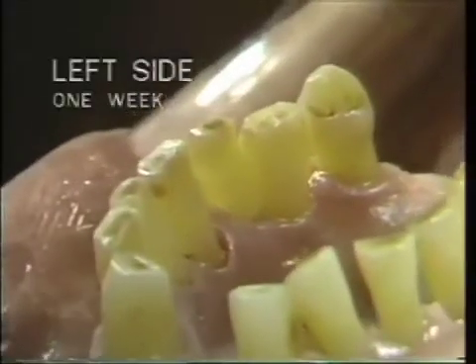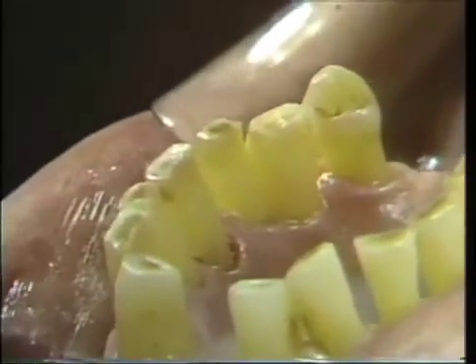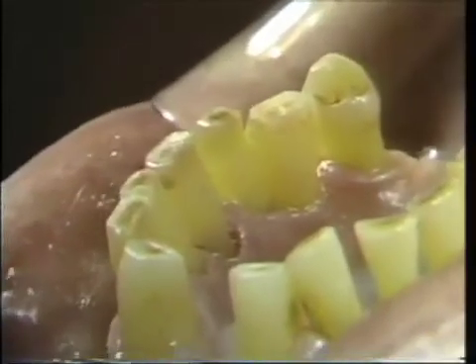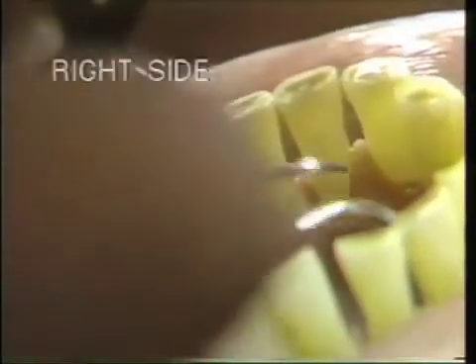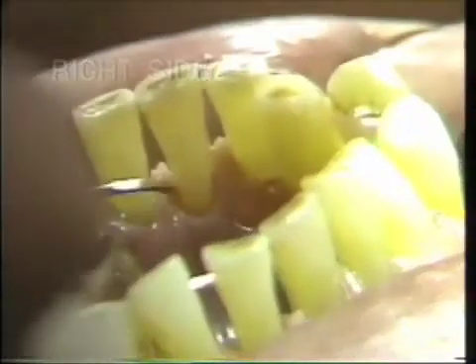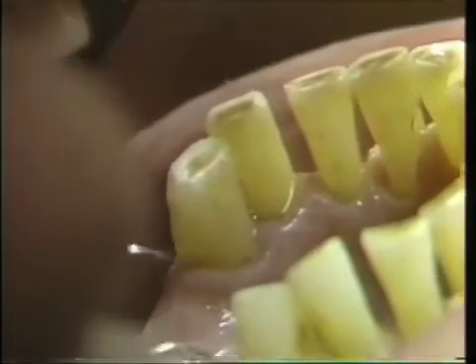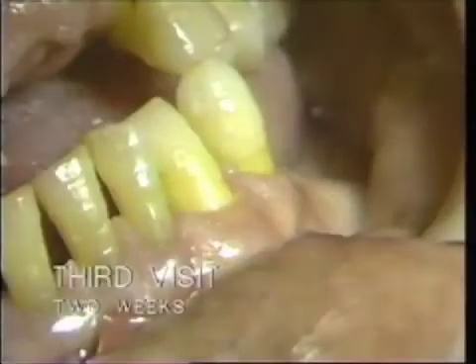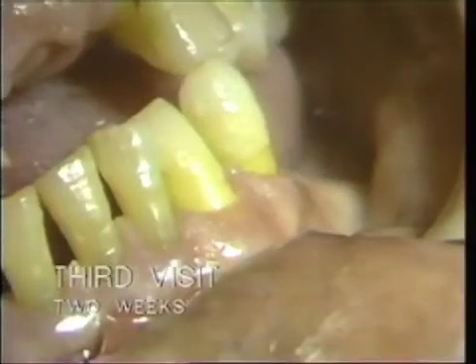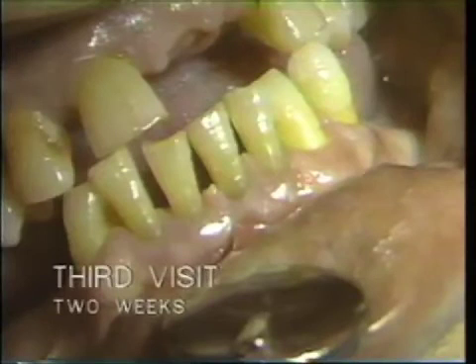So what we have is the left side one week after scaling, and the right side immediately after scaling. There is no tissue damage, but there is still some calculus left, which we will address at the next visit — the third one.